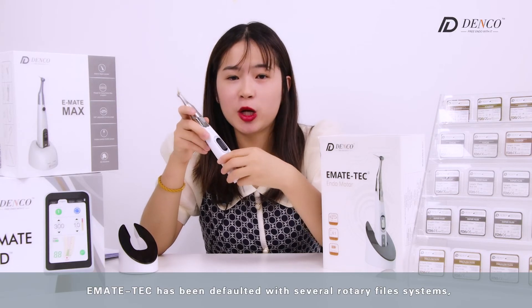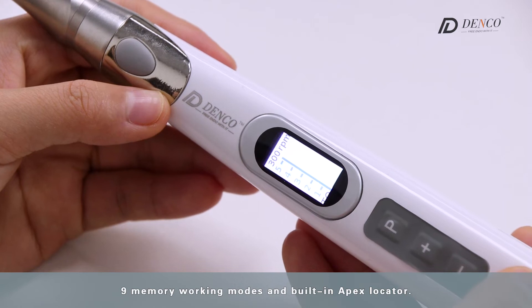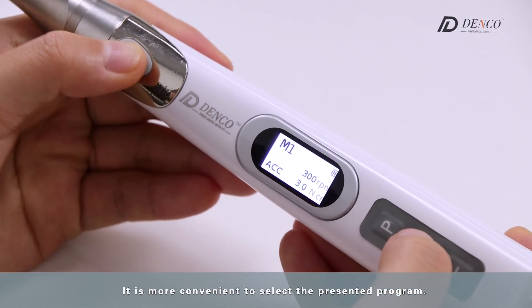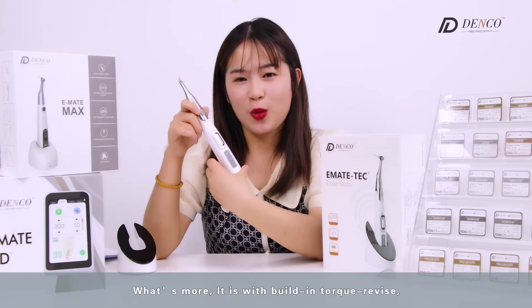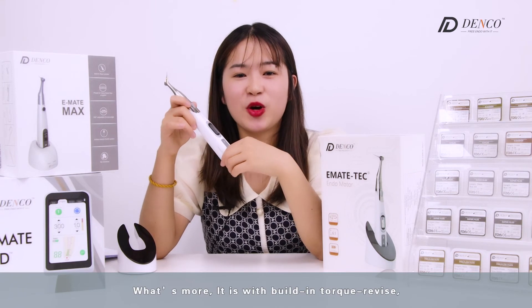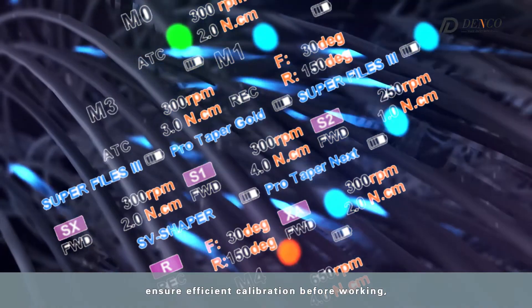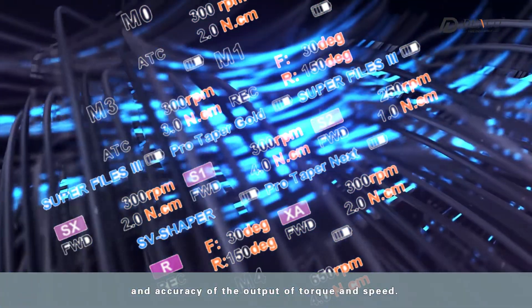With the peak-inch operation system, Emate-Tec has been pre-loaded with several rotary file systems, nine memory working modes, and a built-in apex locator, making it more convenient to select preset programs. It also features built-in torque calibration to ensure efficient calibration before working and the accuracy of torque and speed output.